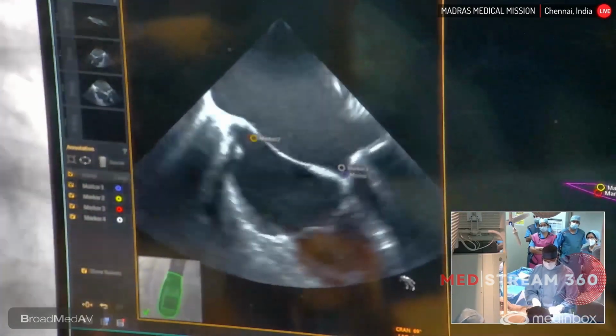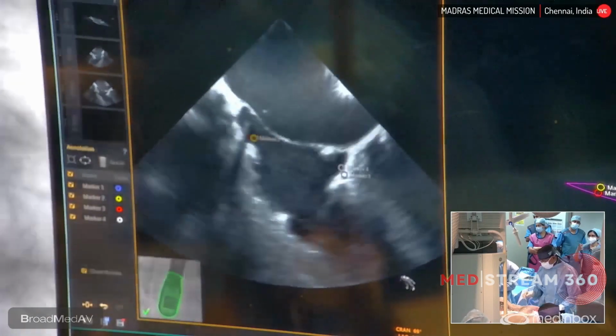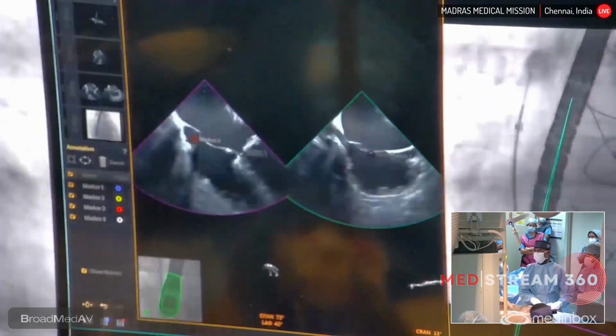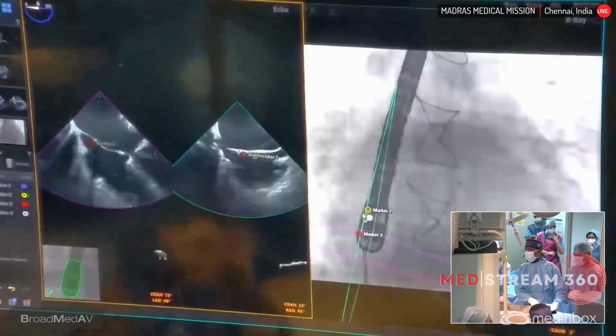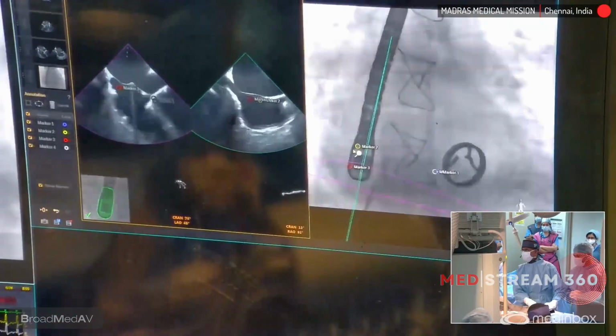innominate vein, and we have a standard BRK1 needle which is going through that 8 French Mullins sheath. This Mullins sheath is now going to be brought down to the interatrial septum. We are progressively coming down, with some sedation given, to the point where I have plotted my echo navigation. So I'm coming to the region of the echo navigation.